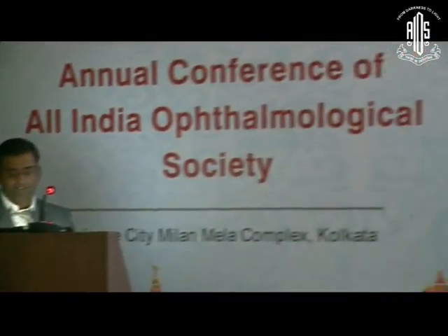A proper wound construction paves the way for a smooth and uneventful phacosurgery. A small incision, farthest possible from the center of the cornea with no gape and no suture, is closest to the ideal incision and will induce the least postoperative astigmatism.